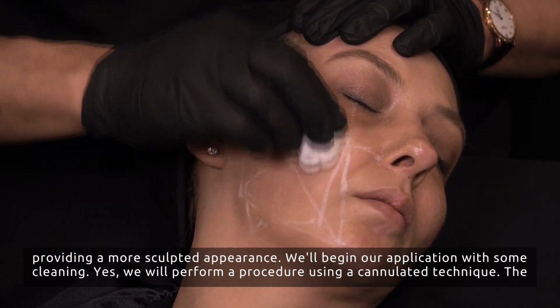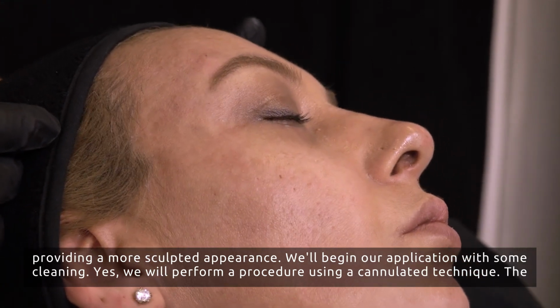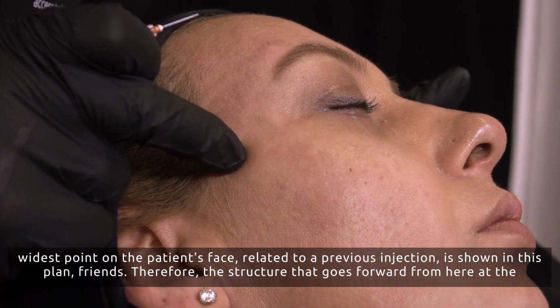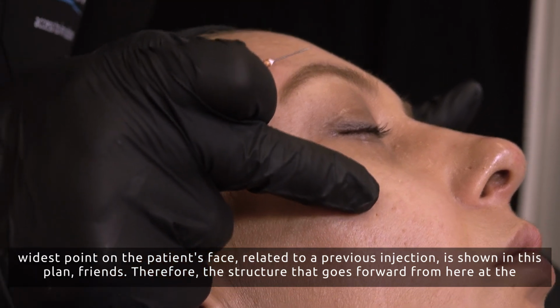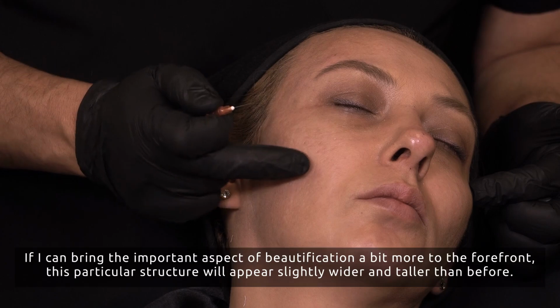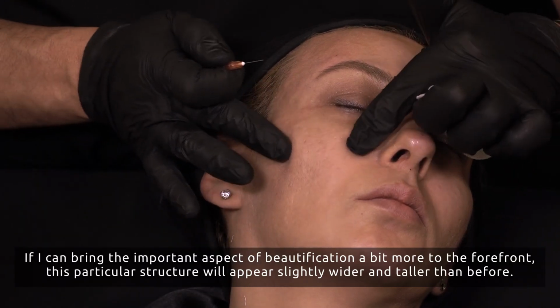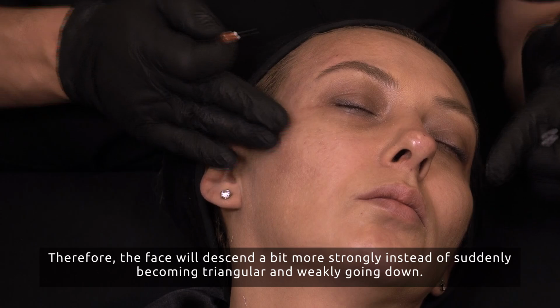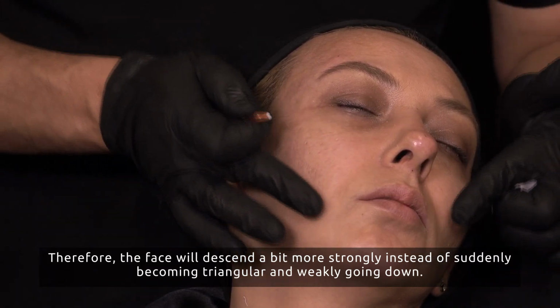We'll begin our application with some cleaning. Yes, we will perform a procedure using a cannulated technique. The widest point on the patient's face related to a previous injection is shown in this plan, friends. Therefore, the structure that goes forward from here is at the narrowest point. If I can bring the important aspect of beautification a bit more to the forefront, this particular structure will appear slightly wider and taller than before. Therefore, the face will descend a bit more strongly instead of suddenly becoming triangular and weakly going down.